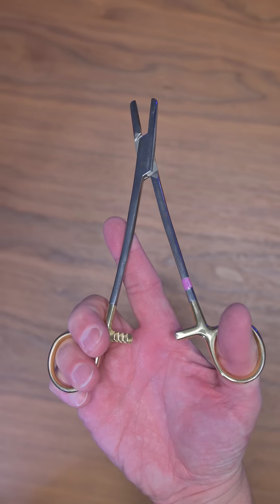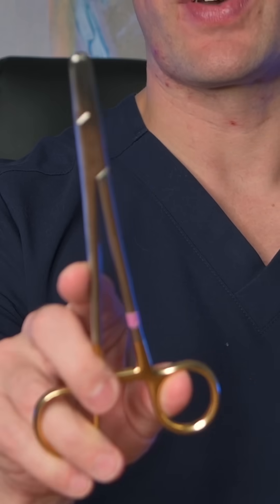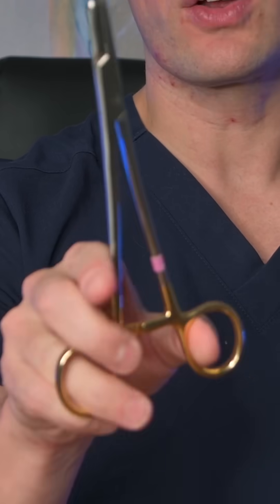This is a heavy duty needle driver and it's held normally with your thumb in one ring and your ring finger in the other. That allows for very easily opening and closing the driver. But the problem is that your fingers are far away from the tip, and that can reduce your control.